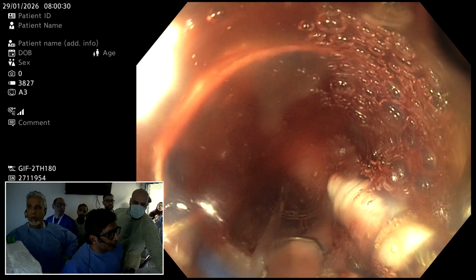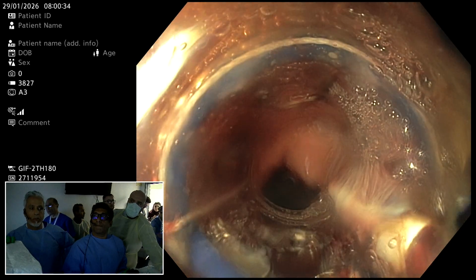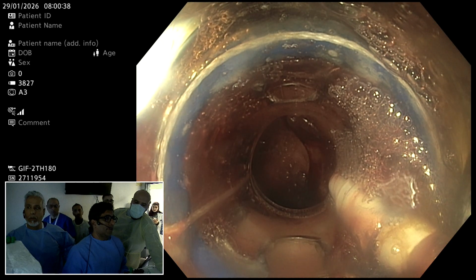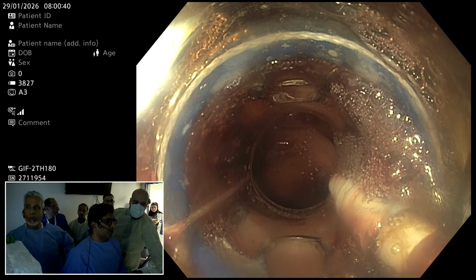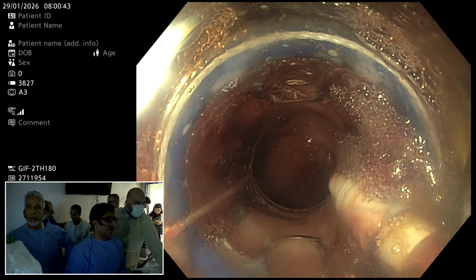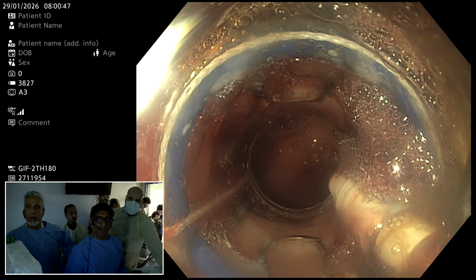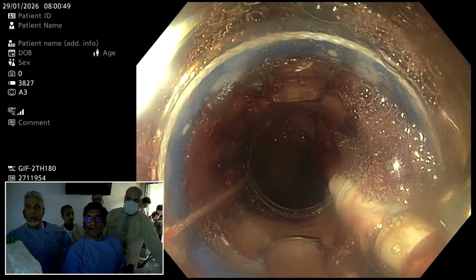Pardon, can you tell it? Yeah, it has to be removed, yeah. Yes. Yeah, because these tumors are prone to metastasis, and it is mandatory to all.